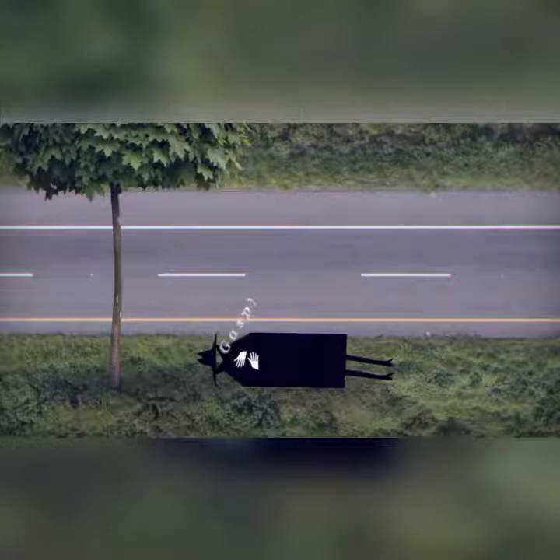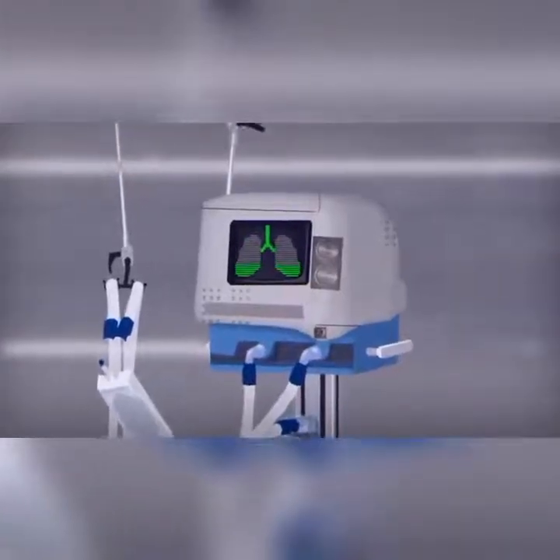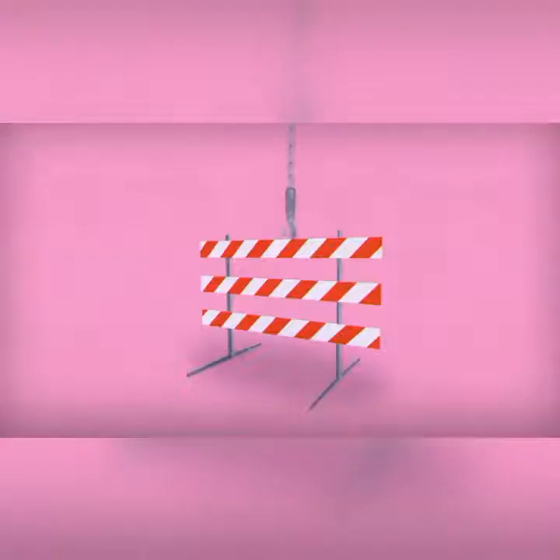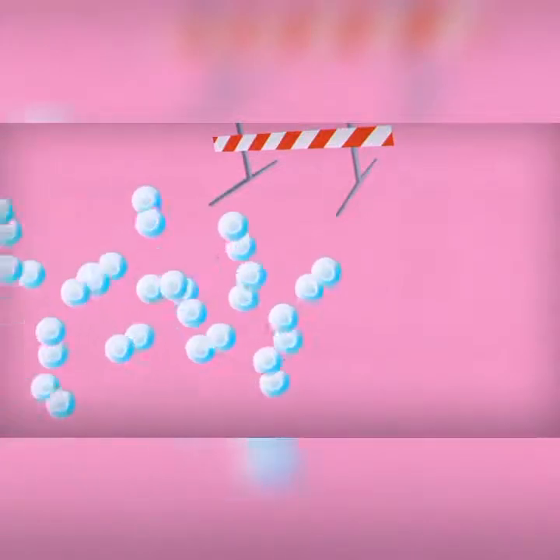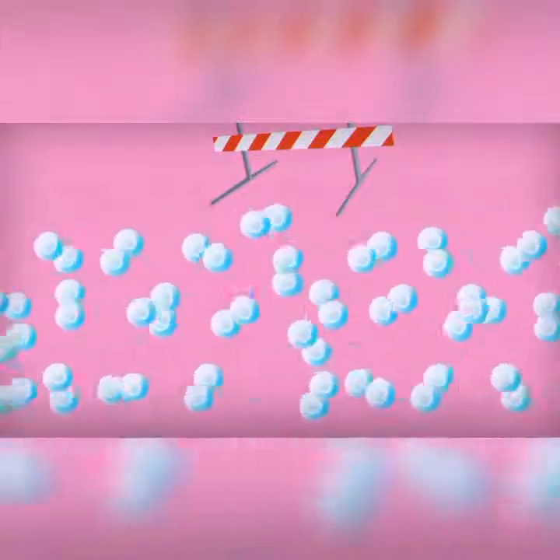All these situations render the lungs unable to function normally. But mechanical ventilators take over the process, getting oxygen into the body when the respiratory system cannot. These machines can bypass constricted airways and deliver highly oxygenated air to help damaged lungs diffuse more oxygen.